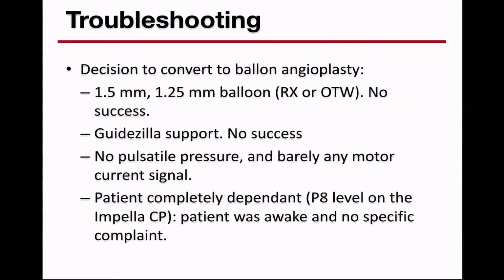We tried a 1.5, 1.25. We put up a Guidezilla that came into the proximal LAD, and nothing would go through the lesion. And the patient was completely dependent on the Impella, and surprisingly, he was awake, talking, and had no chest pain.